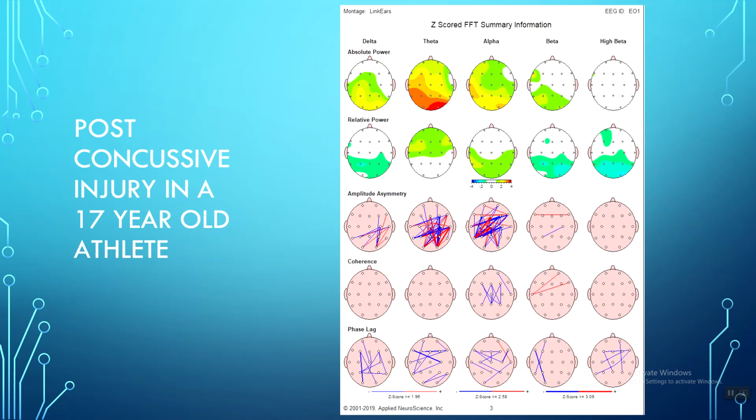Right, yep. Do you know how stable that is? Like if you measured somebody today and next week, assuming you don't do any intervention? Great question. So the question is, how much does it change? Barring significant events and insults, we're really very much the same. We do change throughout development. So we change as we grow into an adult, and then we change as we turn into an old person. But besides that, we're fairly stable. But you'll see with this work that people do change.